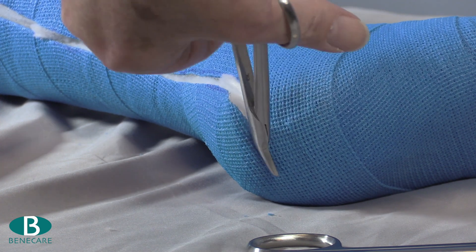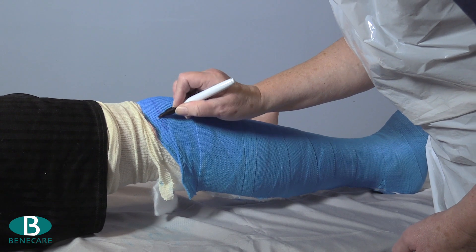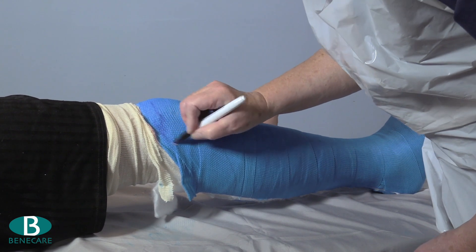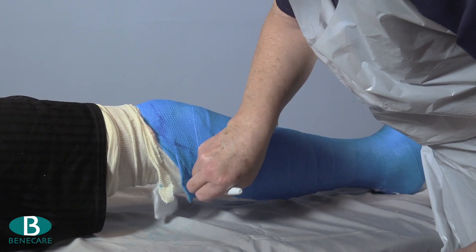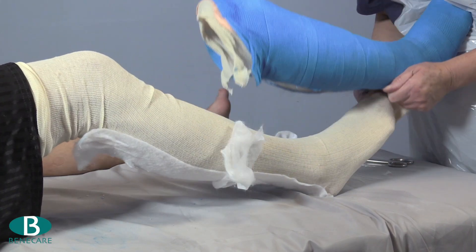Before removing the cast, mark it around the knee to ensure an excellent fit with no constrictions of the knee joint. Then remove the cast from the limb carefully.